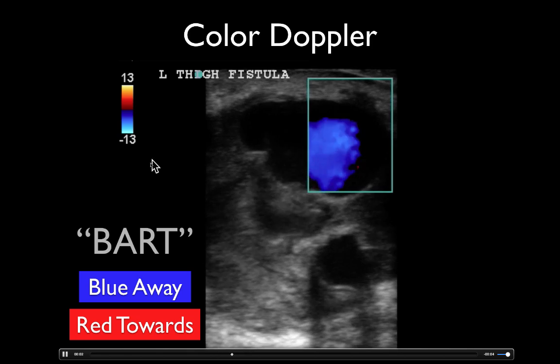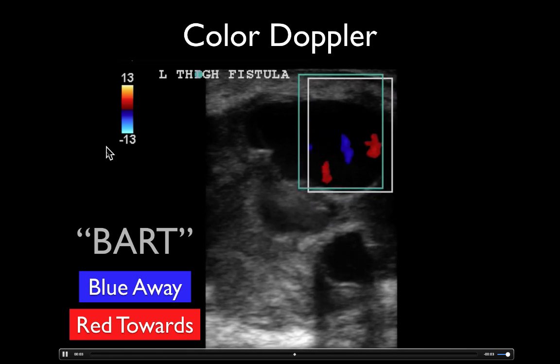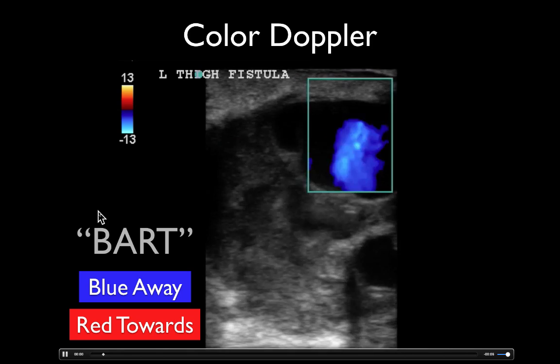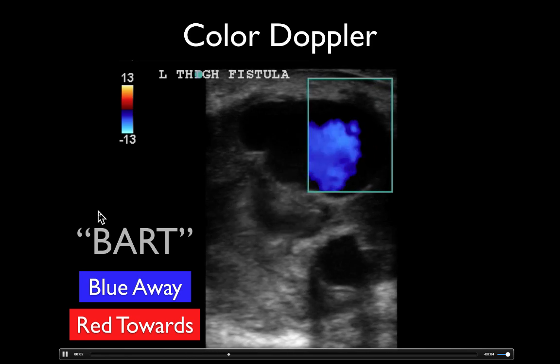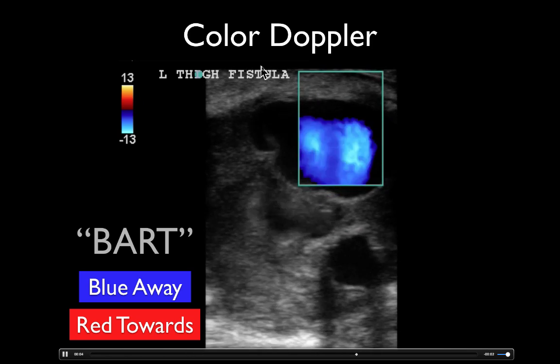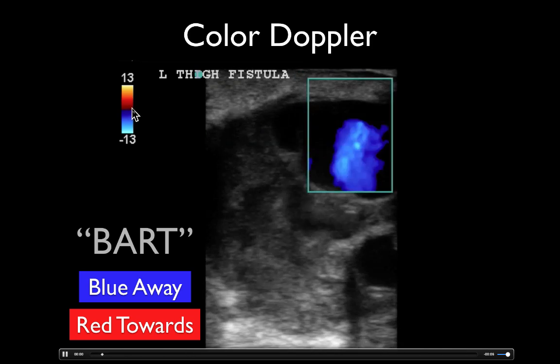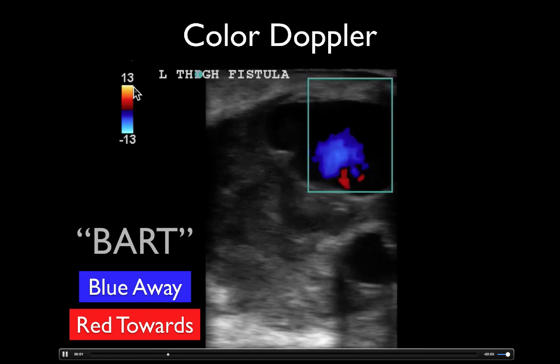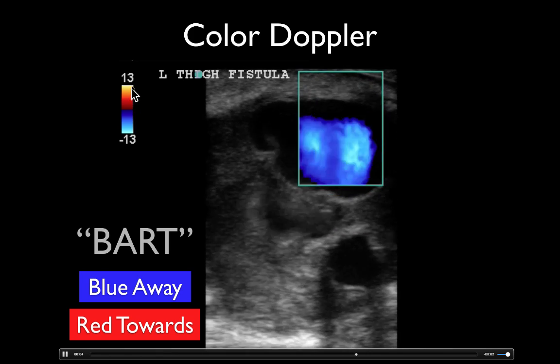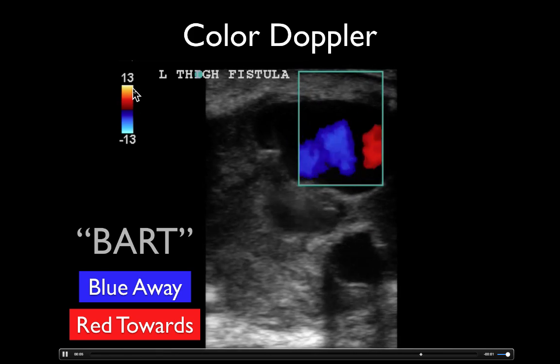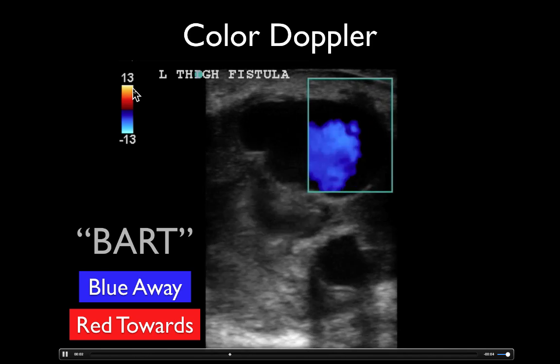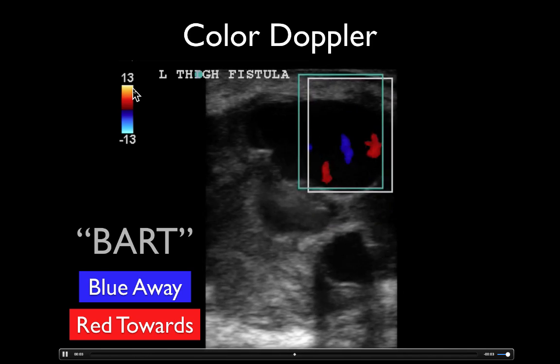What we see on the machine we call BART — blue away, red towards. So if we place the probe here, we've got a scale: blue means flow going away from the probe, red means flow coming towards the probe.